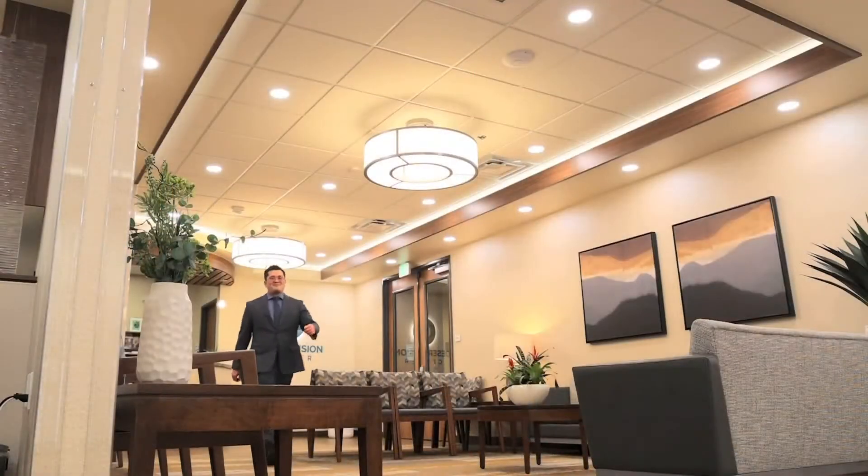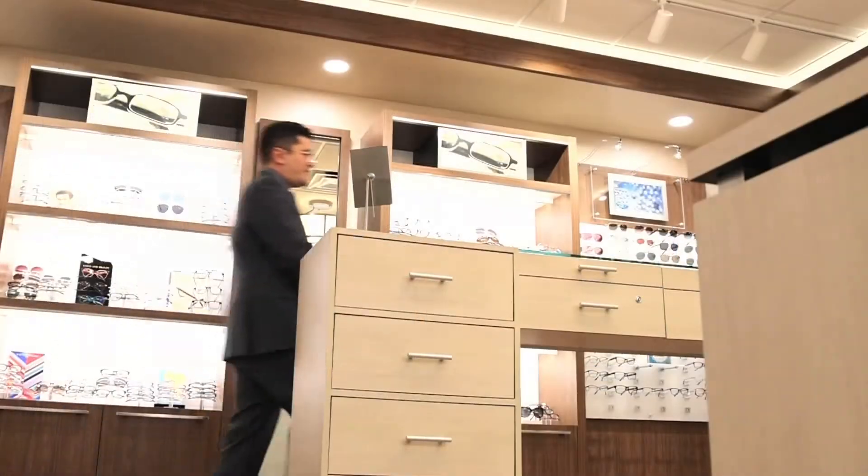What happens when the lens implant from cataract surgery dislocates or falls out of position? In this video, I'll show you, so come along! We always talk about the lens implant from cataract surgery lasting the rest of your life, but sometimes there's trauma or other unfortunate events that cause the lens implant to dislocate years later.